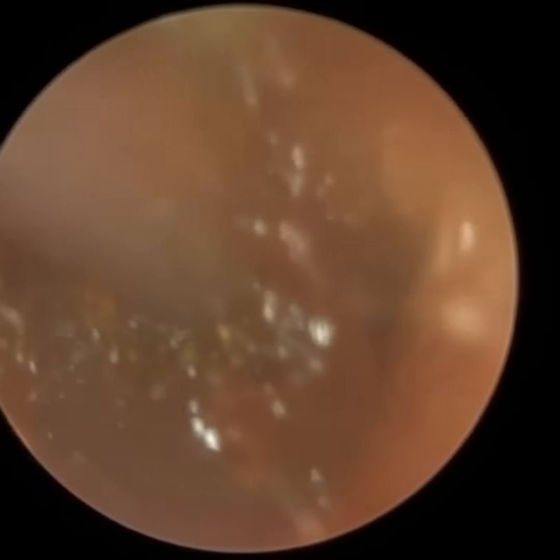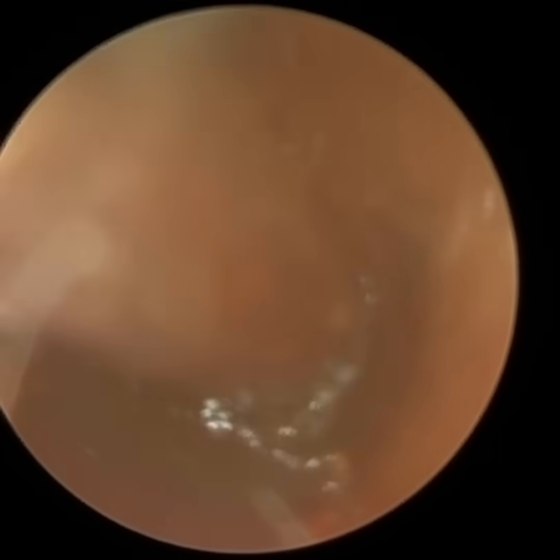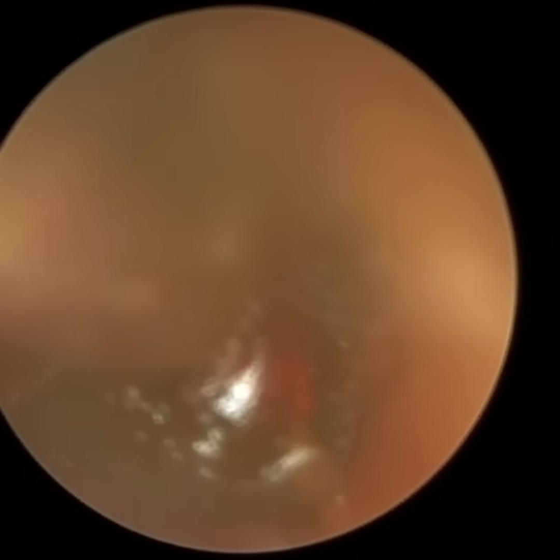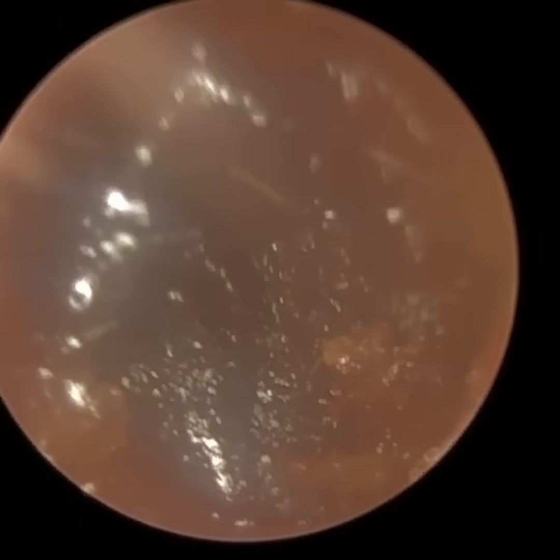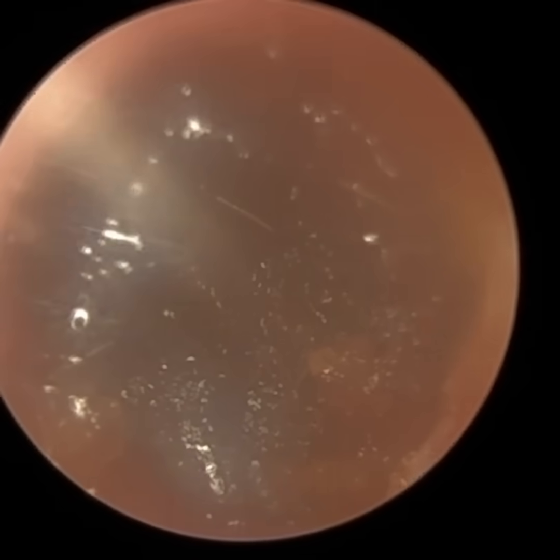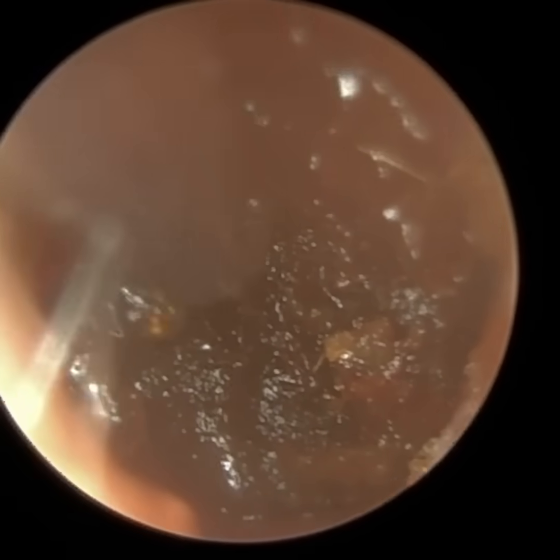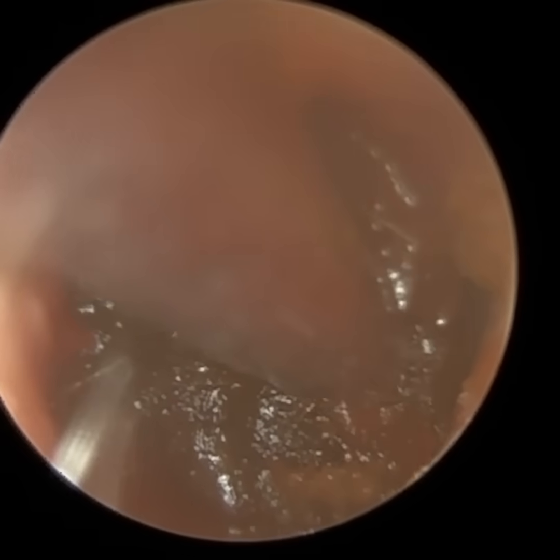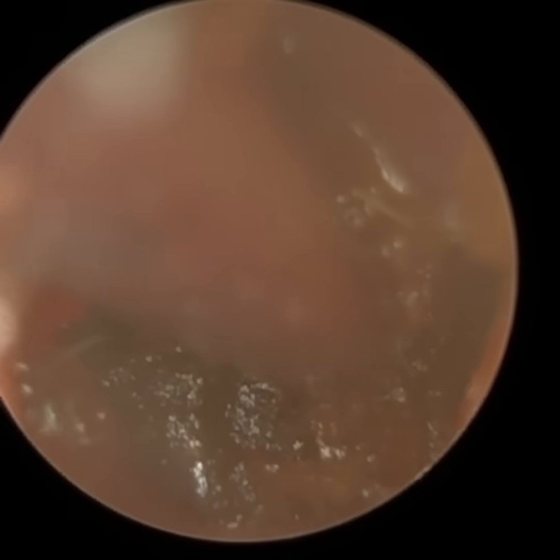So this patient's been suffering from this wax for many years. They visited many specialists, and because the hearing wasn't that good anyway, they just resigned themselves to the fact, really, just to continue with the wax. But they saw a really nice colleague of mine, not too far, and my colleague recommended that they visit myself first to have the wax removed, and then once the wax is removed, they can perform a thorough consultation and go through some possible options other than a BAHA.